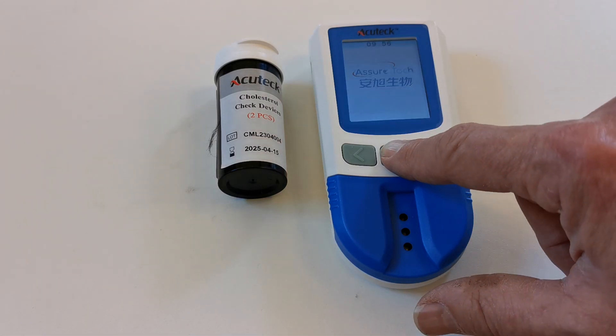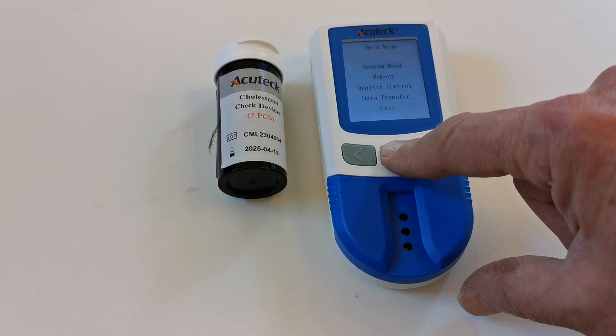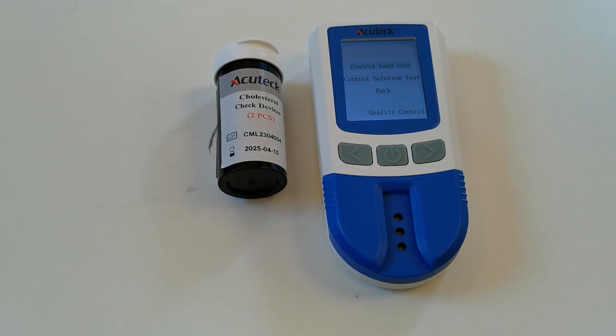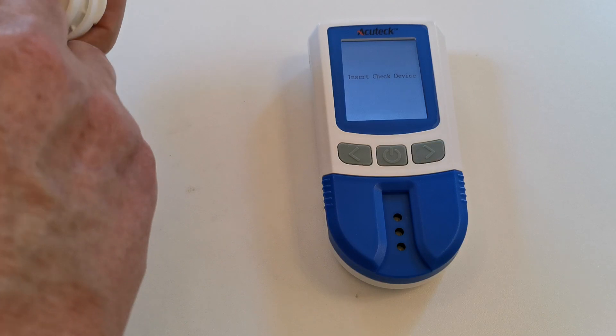To run a check device test on the meter, hold the power on button until the display shows the system menu. Navigate to quality control and press enter. We then want to select control card test and the device will now ask you to insert a test device.